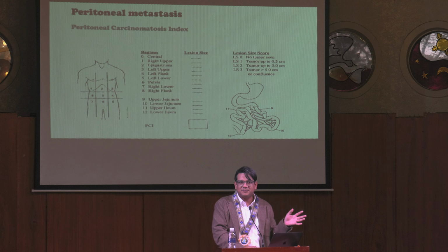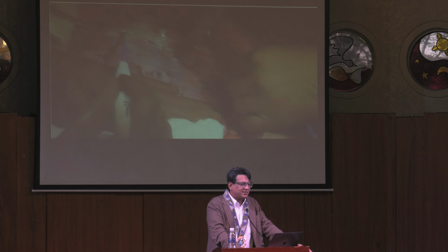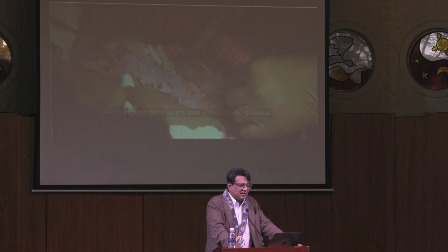Okay, so we are going inside the abdominal cavity, but we're not really inside yet. As soon as we are inside the abdominal cavity, I will tell you. Look at that. Have you lost your appetite? You can see that intestine, you can see those small spots. That's all cancer, okay? So we score the cancer totally and we have to remove each and everything that we see. I warned you, don't tell me I didn't warn you, okay?